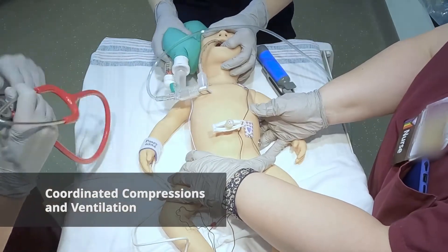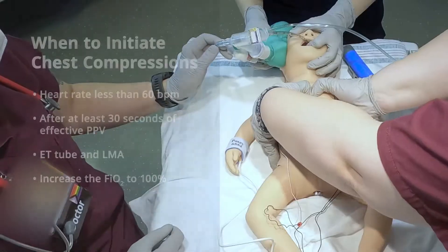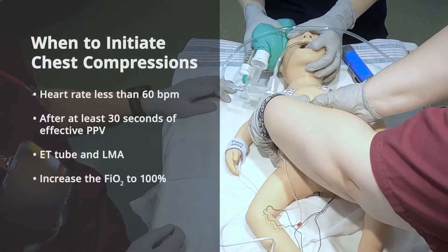Okay, we've got really good air movement. Our heart rate is still less than 60, so let's go ahead and start chest compressions. Turn oxygen to 100%.